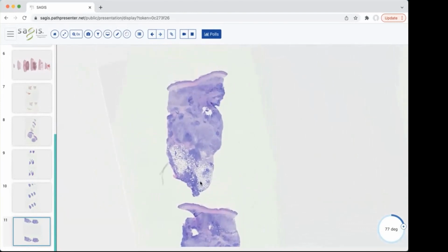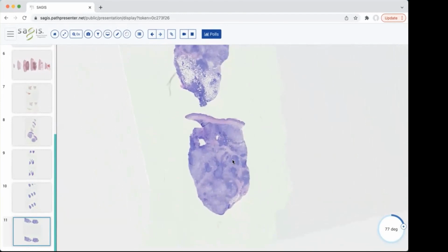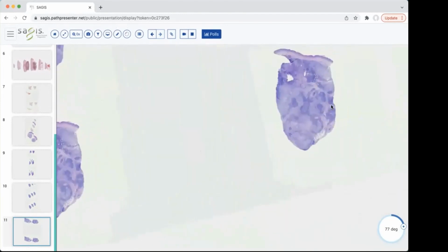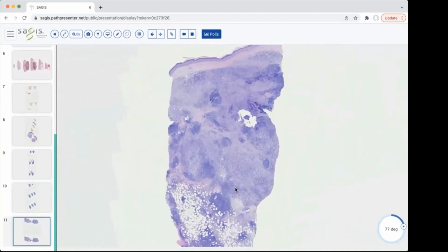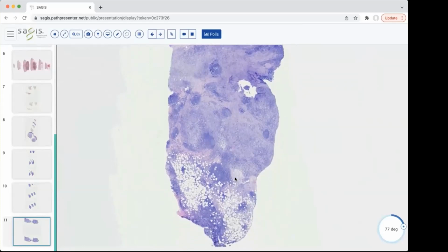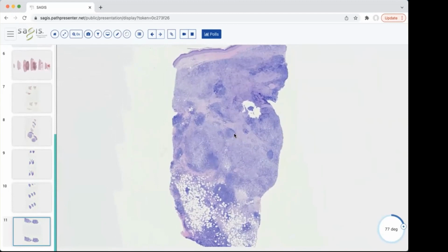I know this is very low power, but I just want you to appreciate that it spares the epidermis and papillary dermis. The infiltrate sort of involves the subcutis here. And even at this low power, some more seasoned dermatopathologists could probably make a diagnosis or at least get very, very close to it. The big thing that people always talk about with these is that there are these nodules with darker staining areas and lighter staining areas. I think that's pretty evident here. This infiltrate usually will involve the subcutis, so this is a deeper problem.